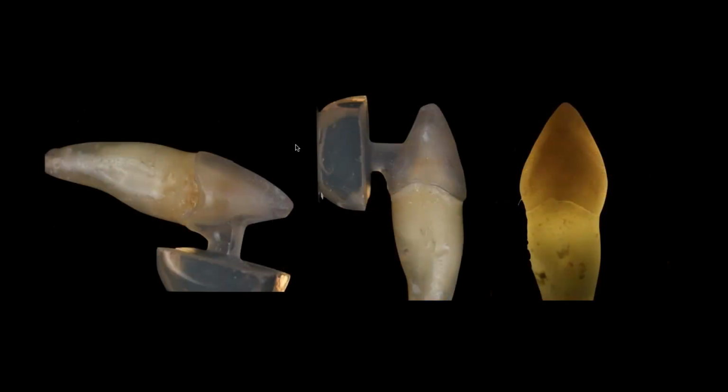So optically, I want to make sure that my materials look more similar to nature. And the reason I said I don't do ceramic margins in my lithium disilicates or silicates is really because I think optically they're getting better and better. This is the Serenity you see on the screen right now. I mill these, and the beauty of this is I can actually fit them back to the tooth or to the restoration. It's kind of in that resiny state, which is really nice.